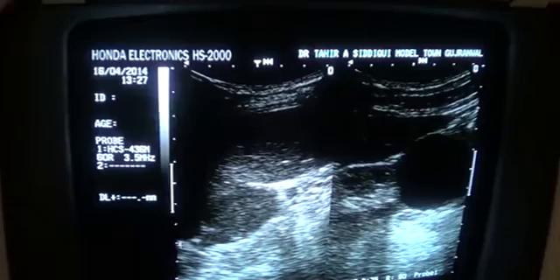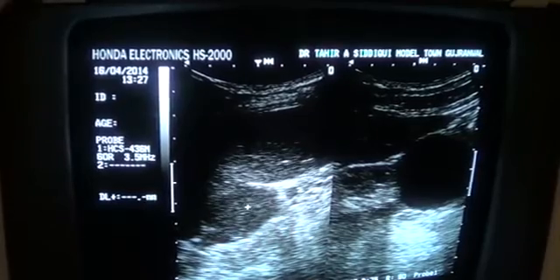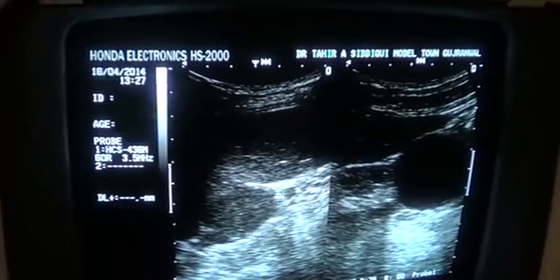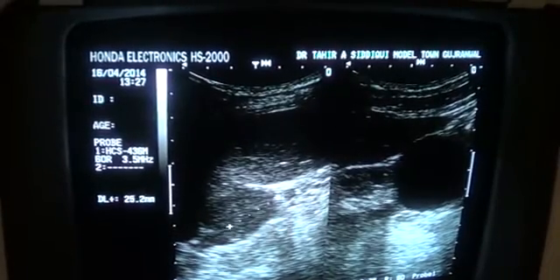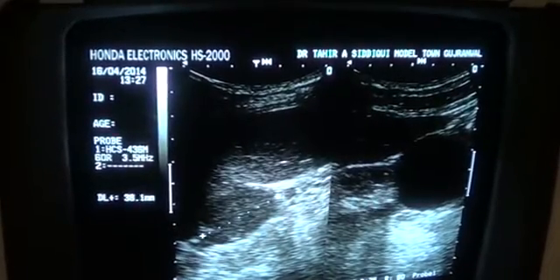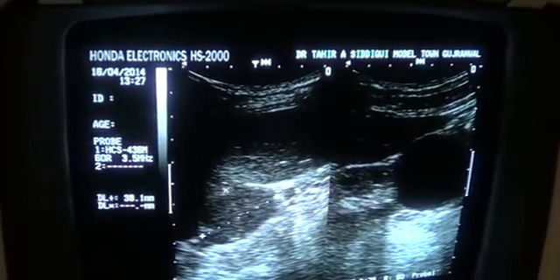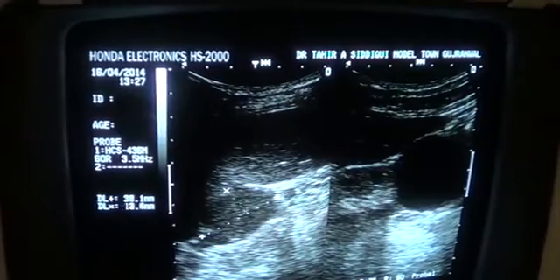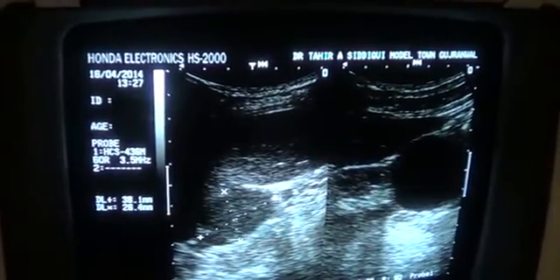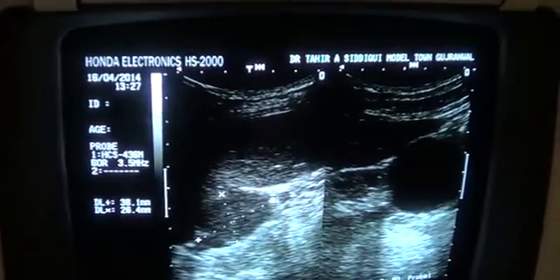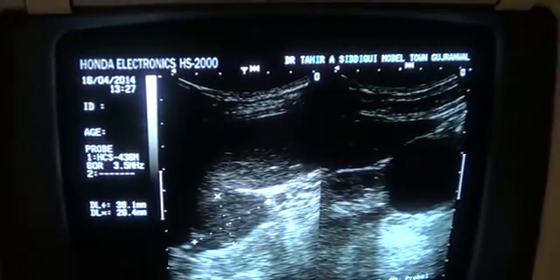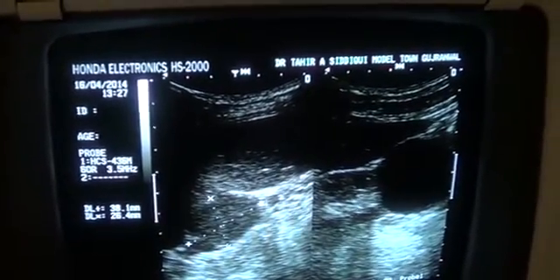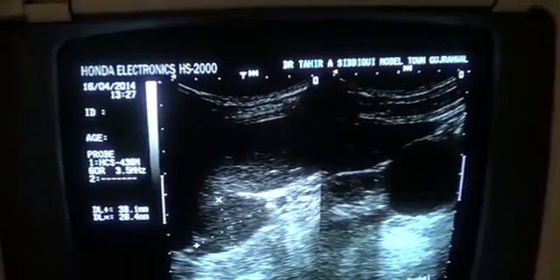This is the mass. It is a hypoechoic solid focal lesion measuring 3.8 x 2.6 cm.